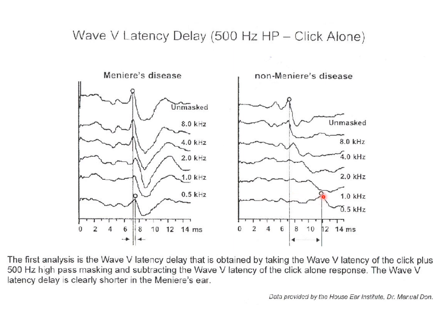In a normal cochlea, when the apical portion of the basilar membrane is wide and soft and floppy, we expect to see a substantial latency delay. However, in Meniere's disease, because of the high pressure from hydrops, the basilar membrane becomes tense, especially in the apical area. Such a delay is now minimized. So again, this shows the undermasking phenomenon.